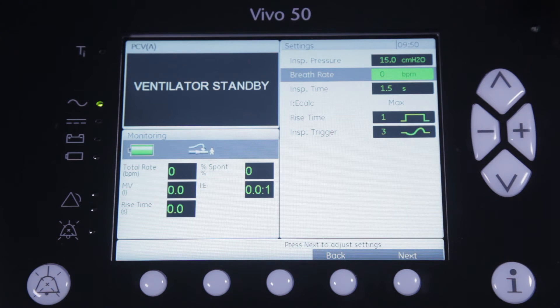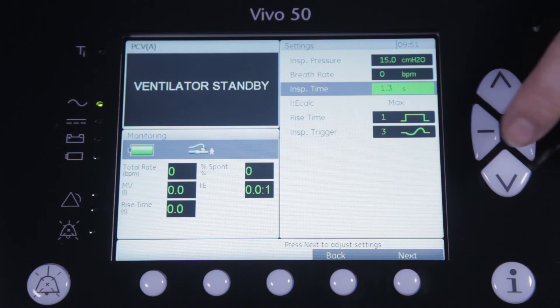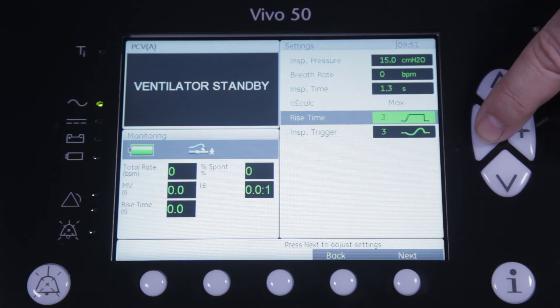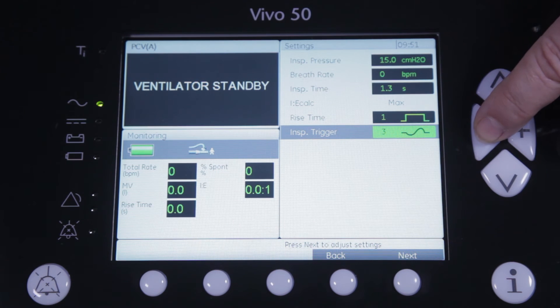Furthermore, you will select the inspiratory time. Next you select a rise time to increase or decrease the peak flow when air is delivered to the patient, and a level of inspiratory trigger to allow the patient to trigger a breath in a comfortable way.